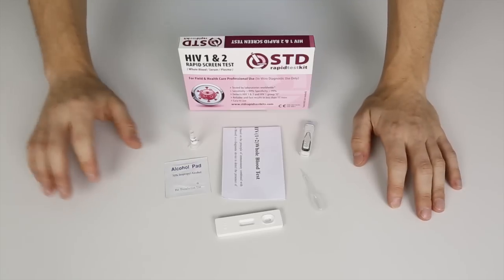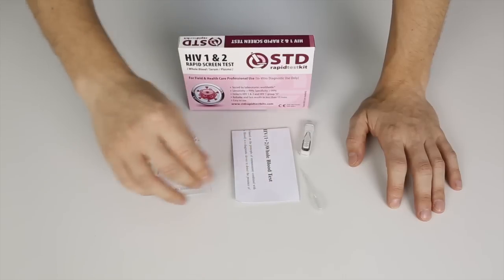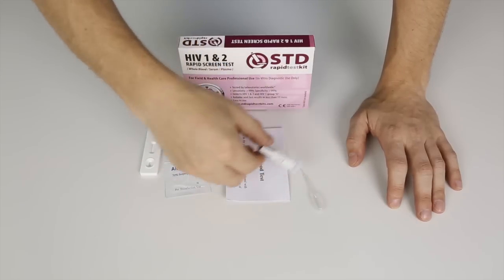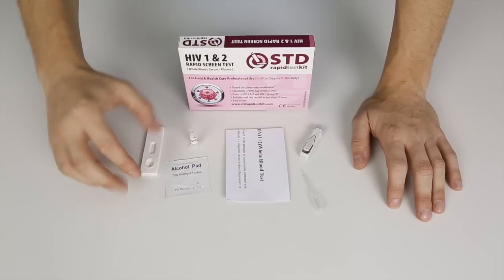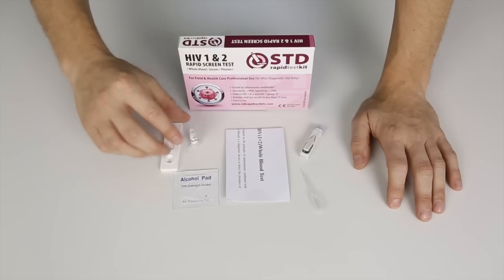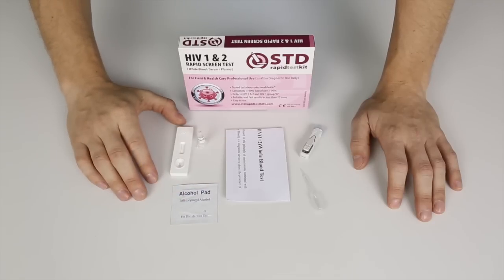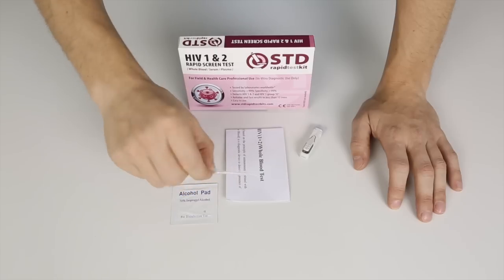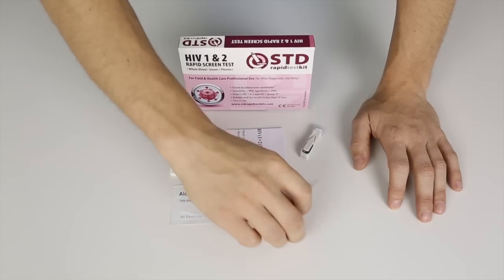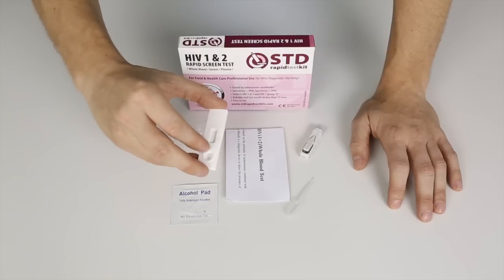It comes with an instructional sheet. It also comes with a lancet that you will use to prick your finger with, and it comes with a sterile pad. It also comes with a micropipette — that's the one you use to draw blood out of your finger with — and the test cassette itself.